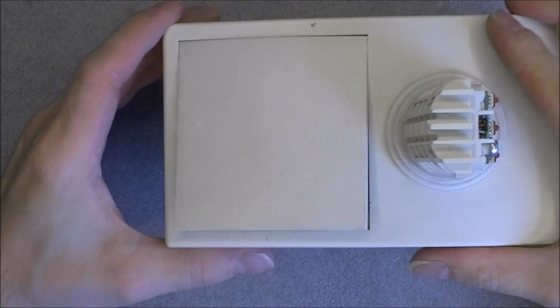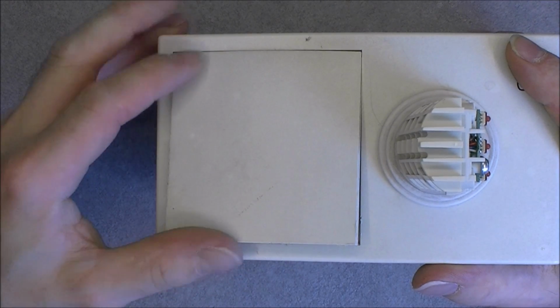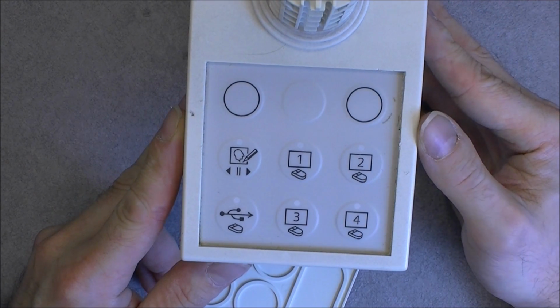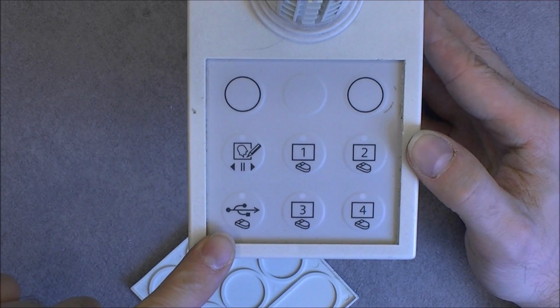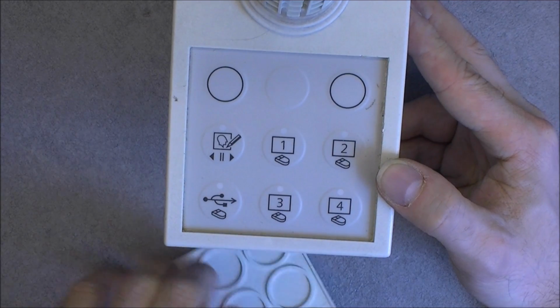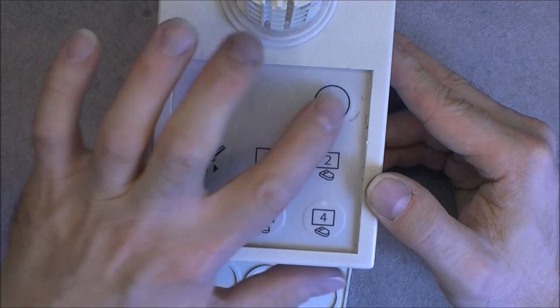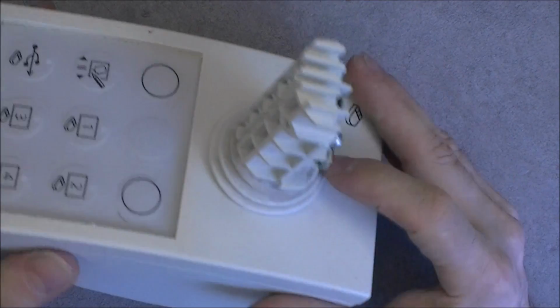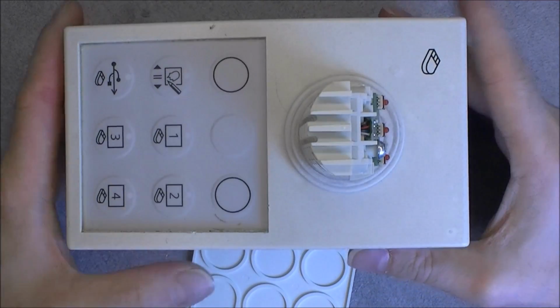And lawnmower outside. Nice. So what do we have, guys? Look at this. We have a secret keypad with a USB logo, and it looks like you can control or configure up to 4 controllers. This is interesting. So these are real buttons, these are fake, there is nothing behind. So not expected at all, this thing. And you can see the below piece is quite dirty here. I will try to clean it before reassembly.